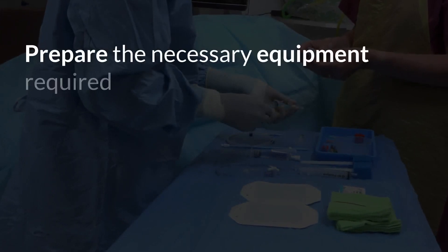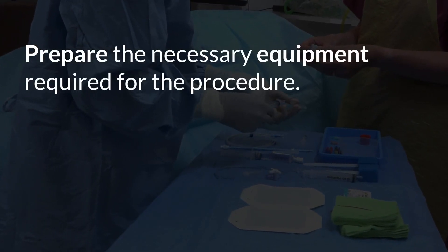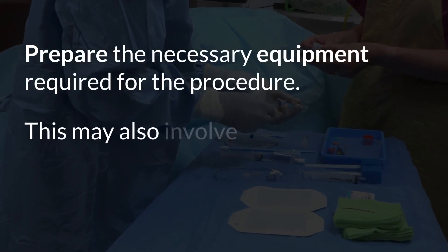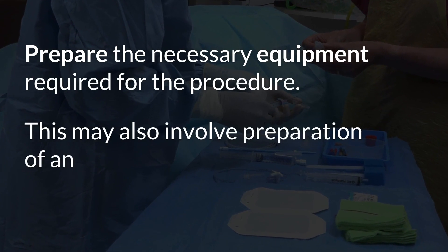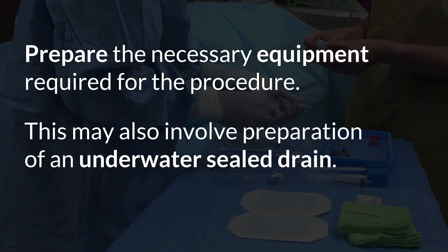Prepare the necessary equipment required for the procedure. This may also involve preparation of an underwater sealed drain.